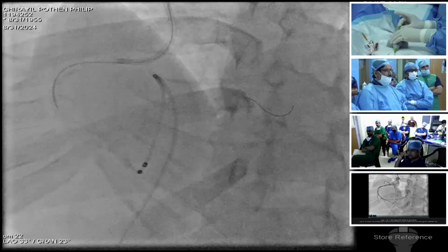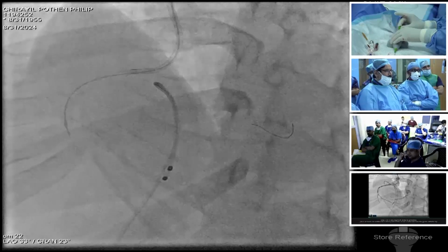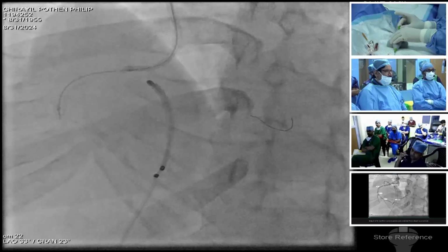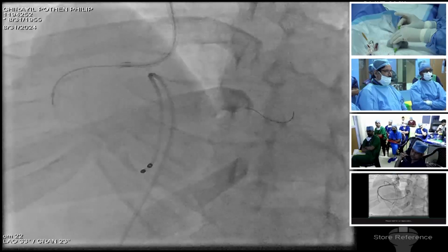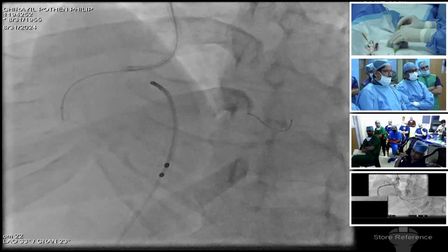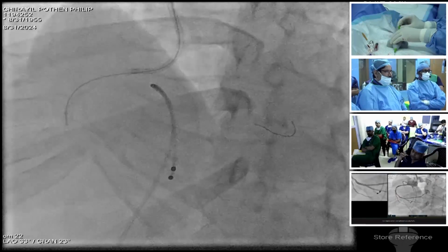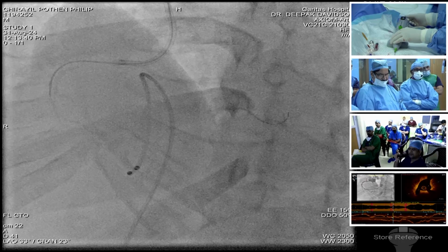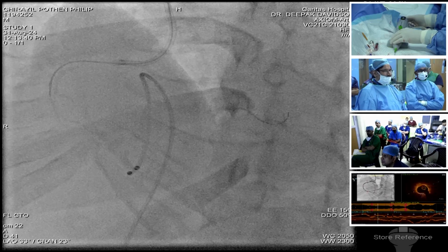Till the edge I will do and I will come back again. Yes. A little more we can go distally. I'm coming back again. No, bradycardia has happened. Some retrograde will be. It's ectopic only. That's all. Nothing actually. No brady.